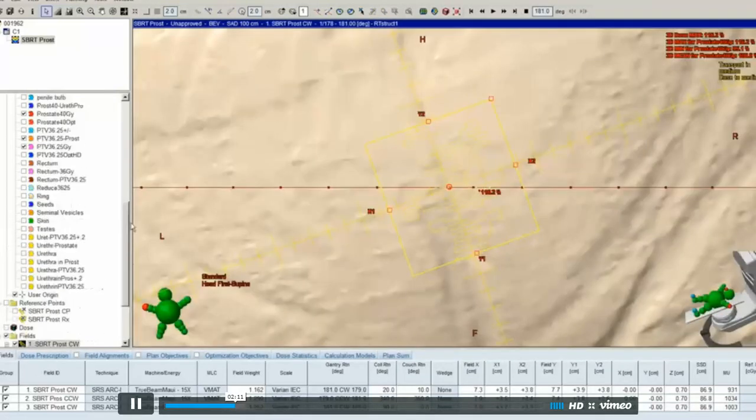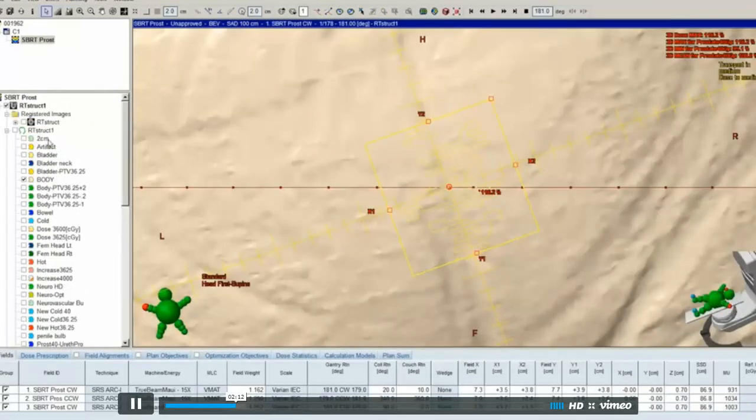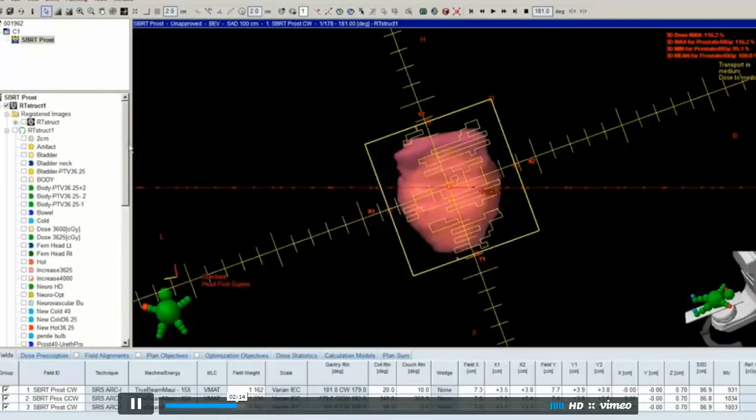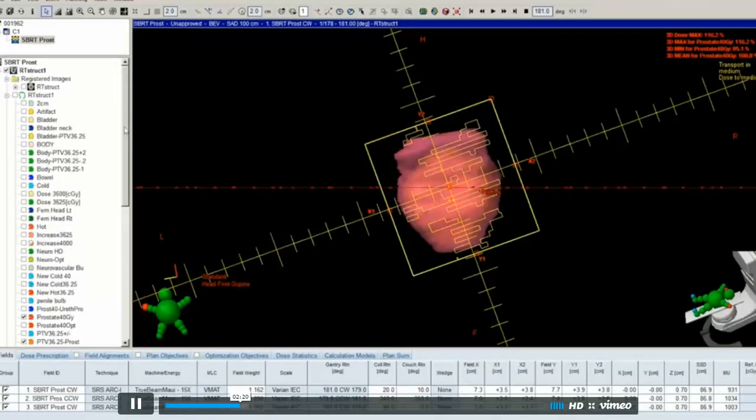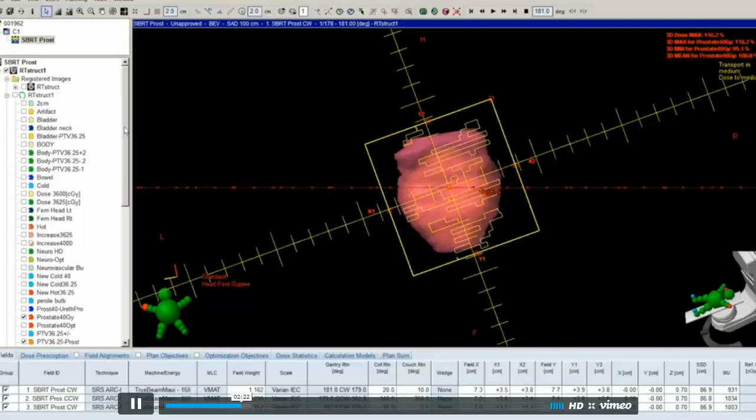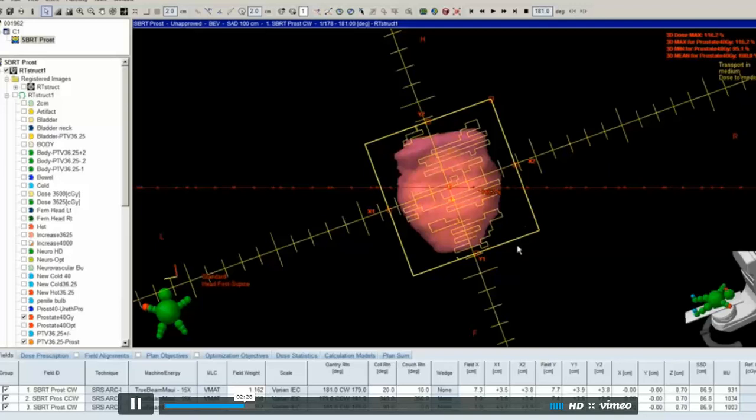I tried to limit my field size as much as possible, make it very tight, and in that way I was hoping to decrease scatter to the testes and the bowel, because the ideal number for the bowel and testes was zero.